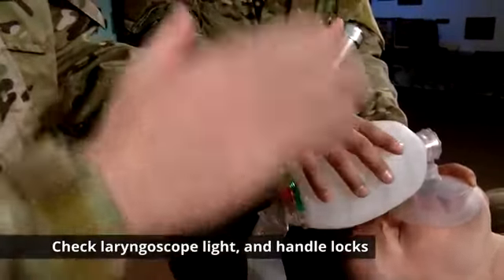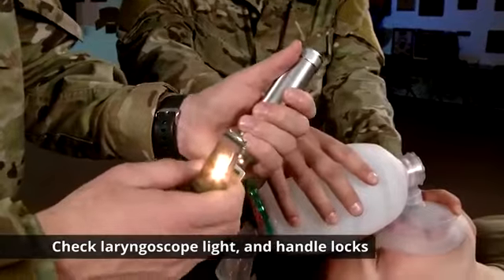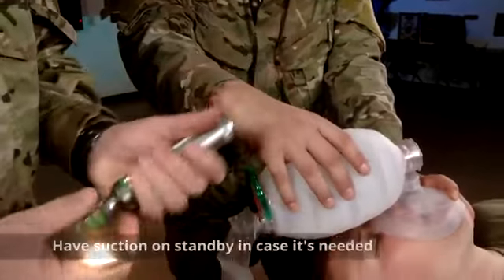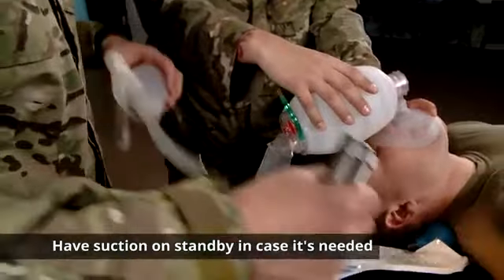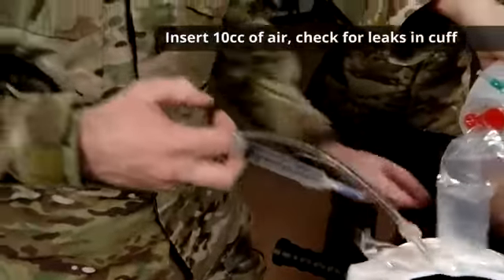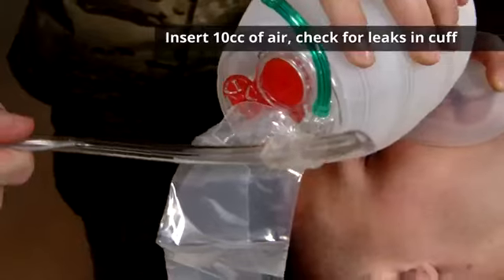Check your laryngoscope — make sure the light is bright and your handle is tight. Also, if you have suction, make sure you have it on standby in the event you need to perform any type of suctioning. Insert 10 cc's of air and make sure there are no leaks in your cuff.